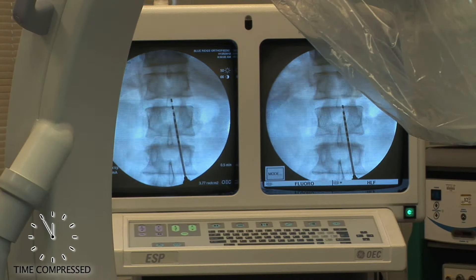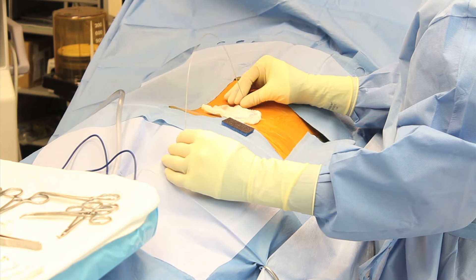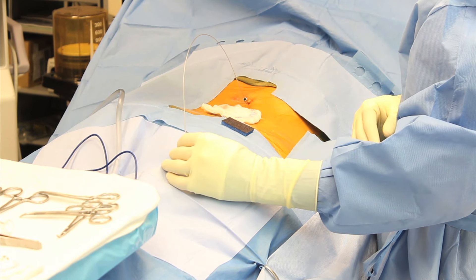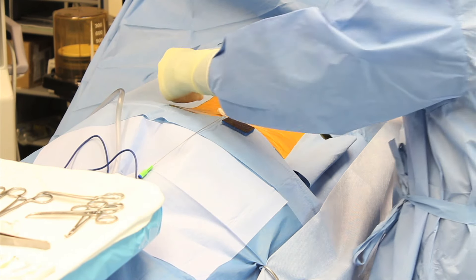The x-ray screen shows the separate eight-contact electrode wires being placed. The companies make a variety of different electrode arrays that can be placed through a needle, which is percutaneously, which is a less invasive style of surgery.